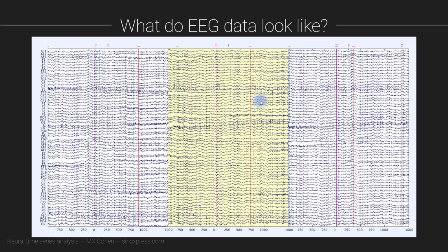These kinds of markers are important because they allow us to synchronize what's happening inside the brain with what was happening in the behavior on the screen. Maybe there were sounds playing, whatever is the nature of the experiment. Okay, so this gives you a bit of a sense of what EEG data look like.